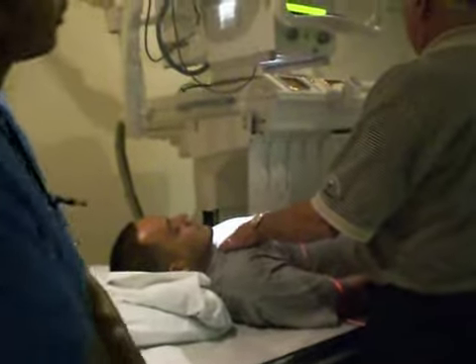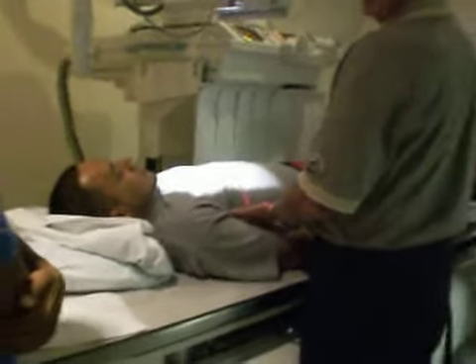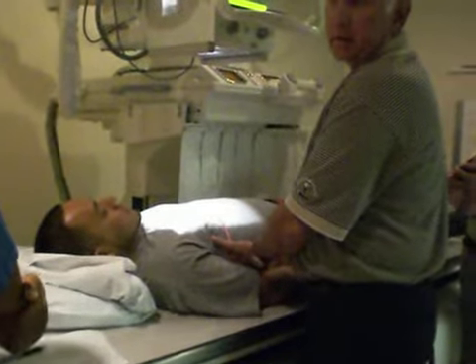Let's say he has, he's complaining of his ribs, fracture, his rib pain, right side. Now, how am I going to do the oblique?